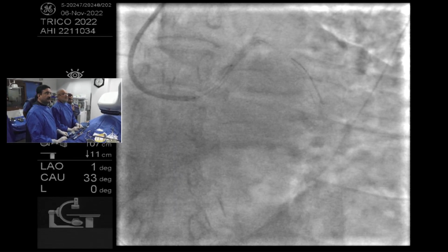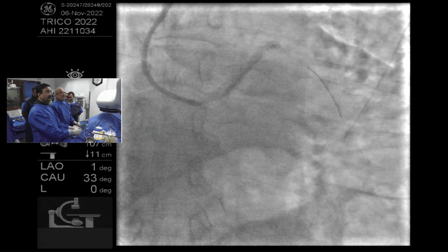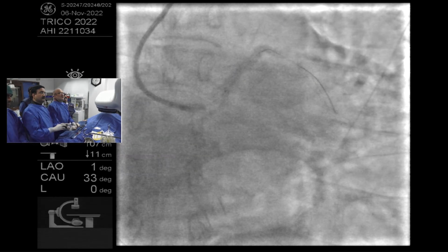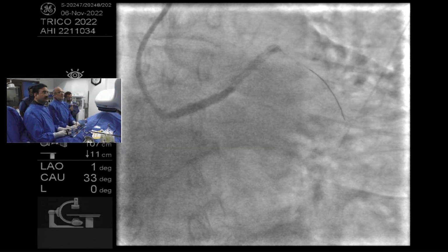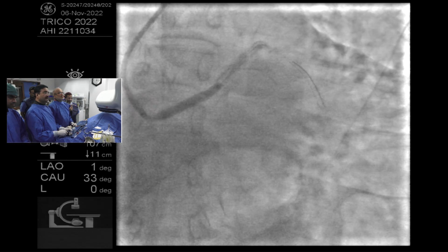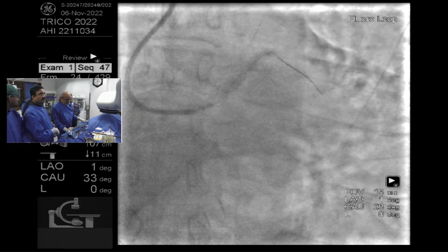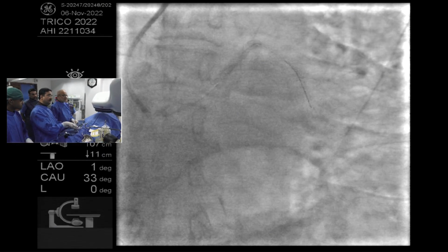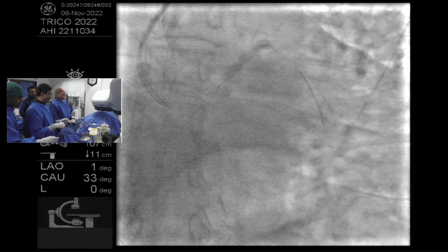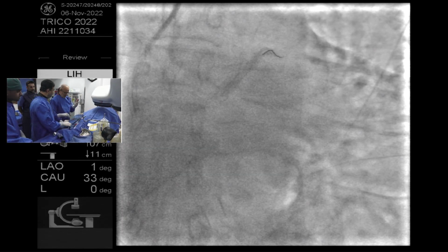You said the left main was a 4.0? The left main is almost 4.5. Yeah, go. I will pull it back. Go to 6.8 when it starts to inflate. Yes, sir. Go. 12. I think enough. Then we'll take another non-compliant balloon and go. If you're relatively certain that the edges of the stent are against the vessel wall, my typical practice in these situations is just to take the NC balloon, because then you're controlling the proximal and distal edges. If you're not confident, then that's exactly it. No problem. We can push balloon. That's right.